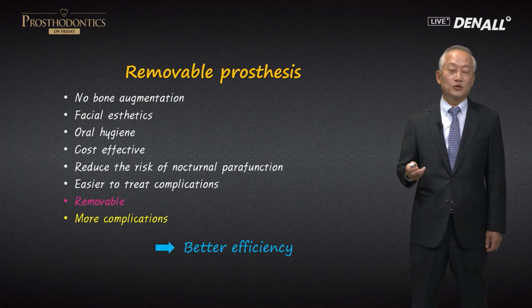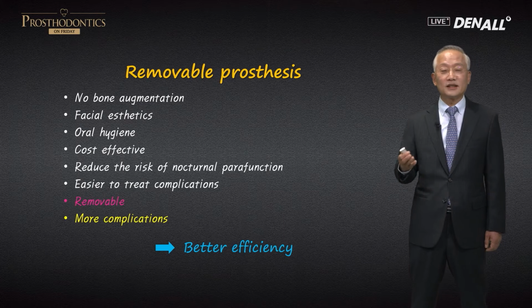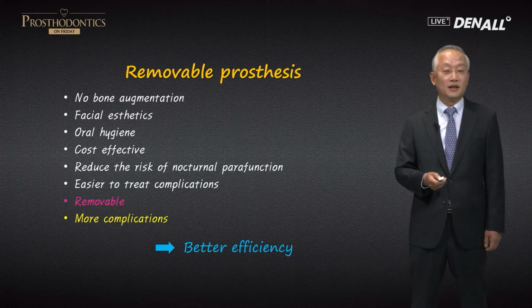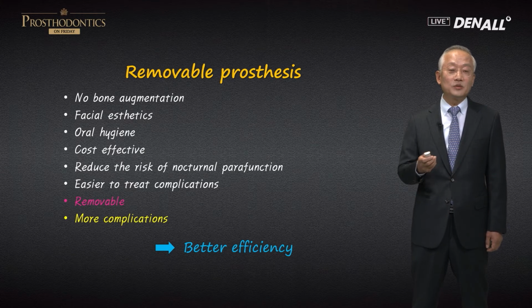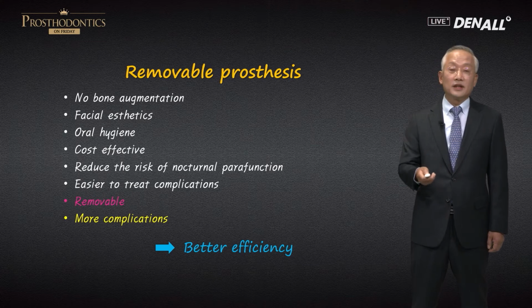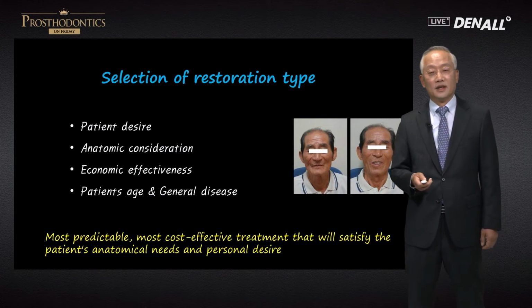Removable prostheses have many pros compared to fixed. It doesn't require bone graft. Oral hygiene, aesthetics, it's very favorable, it's cost effective, and it has low risk. However, the biggest shortfall is that it's removable. It's very efficient, however, it's removable, so that's the main disadvantage.